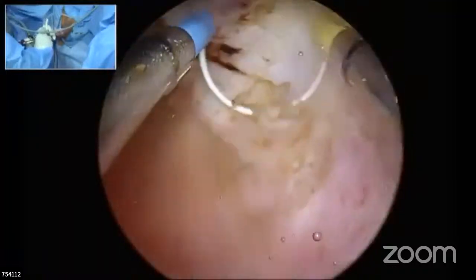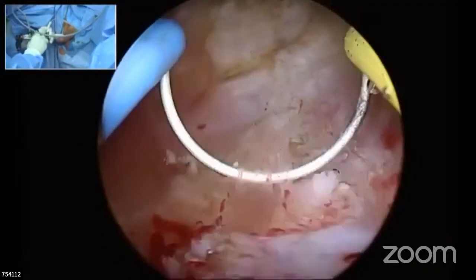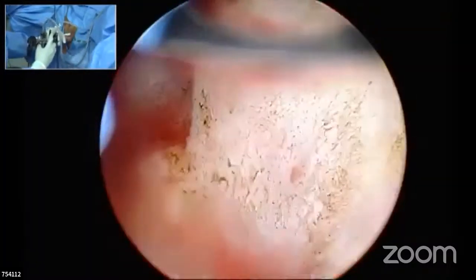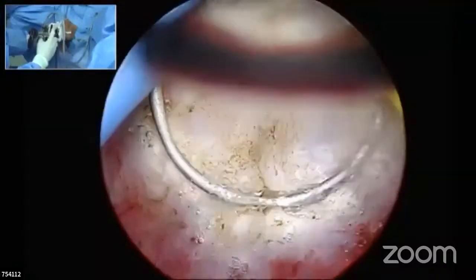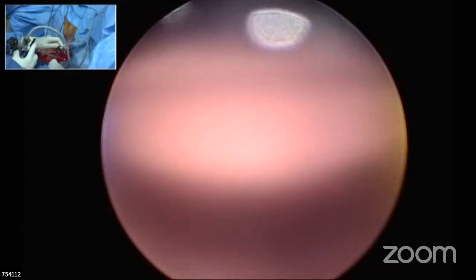Correct. That's the reason why, when you demonstrate prostate resection, many people say, "Don't show me how the fossa looks when the bladder is full. Show me the fossa when it is half empty." Am I right, sir? Correct. Absolutely. I agree, 100% agree with you. Because when the prostatic fossa is distended, it will stretch out. And when you decompress, suddenly you will see a lot of tissue is still there.